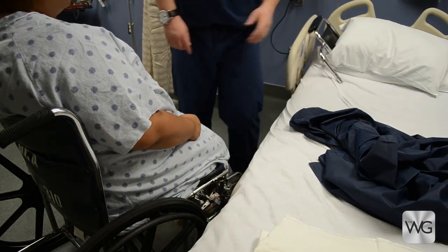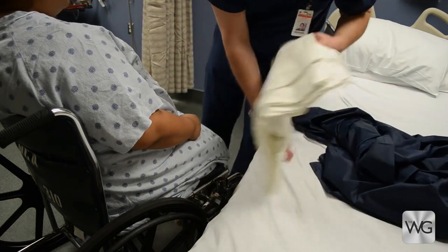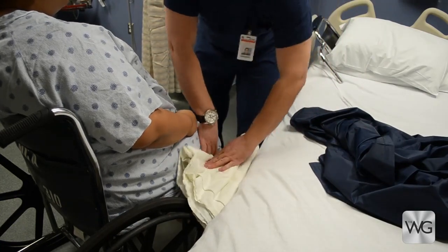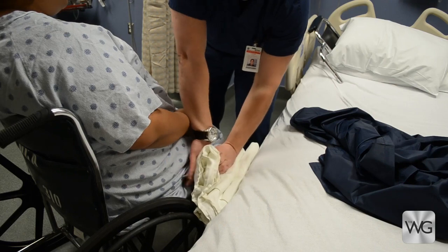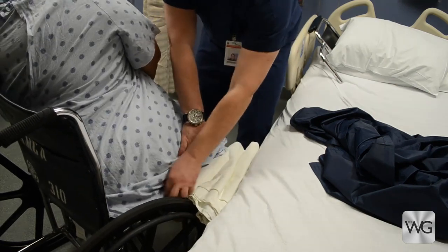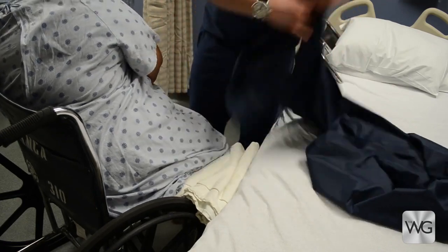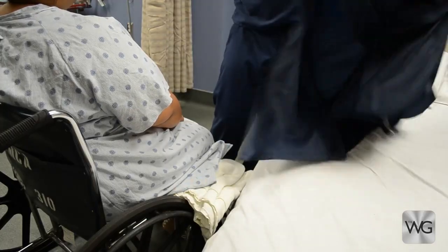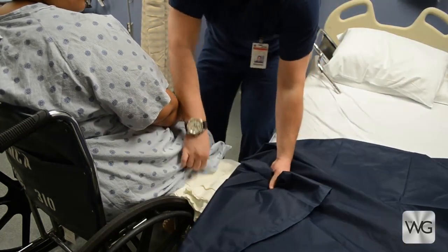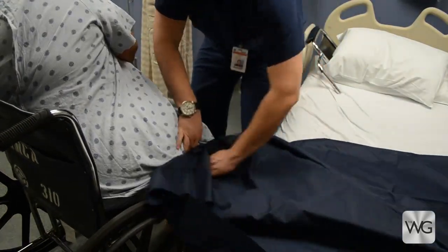To transfer from wheelchair back to bed, ensure the mattress is slightly lower than the wheelchair seat. Pad the space between the wheelchair and bed with folded bed linen. Take a single slide sheet, fold it in half, and tuck the slide sheet under the patient's bottom and thigh.